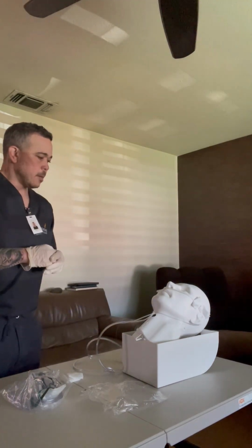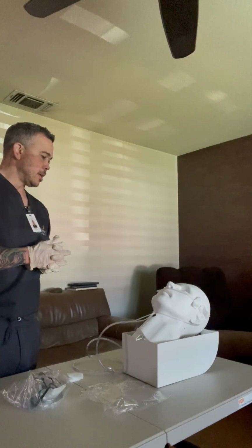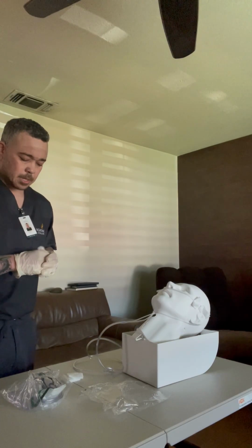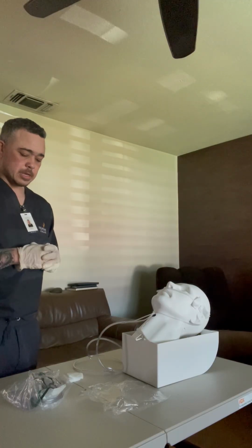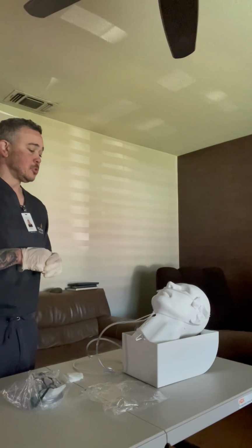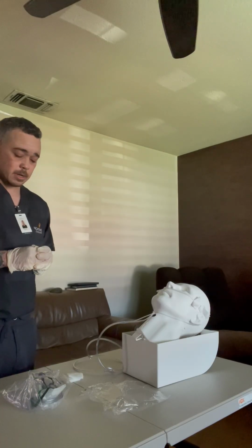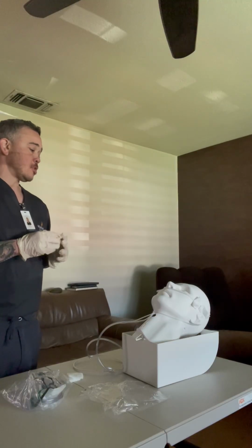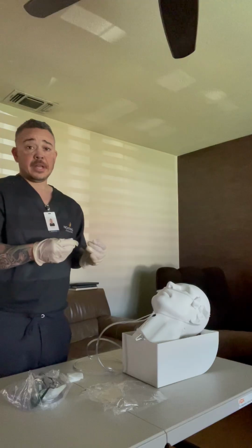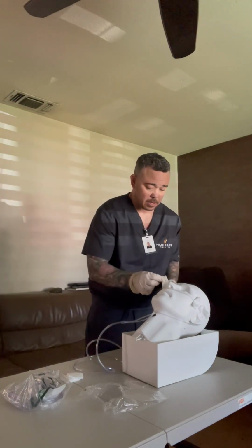Okay, sir. The next thing is your doctor put in another prescription for oxygen for the non-rebreather mask. Okay. So what we're going to do is take off the nasal cannula, and we're going to go ahead and put on the non-rebreather mask because your oxygen level is still a little low, okay? So the next thing I'm going to do is go in and take off the nasal cannula. So I'm going to go ahead and remove the gauze.